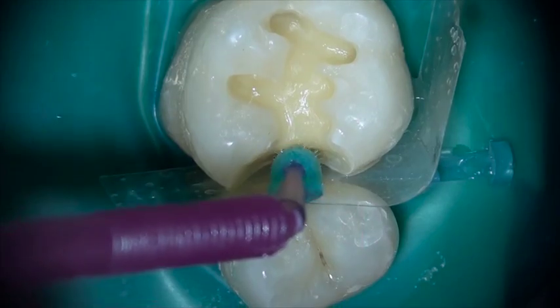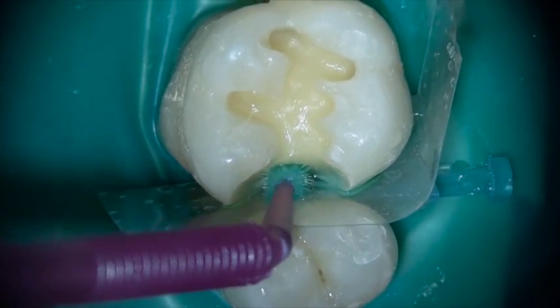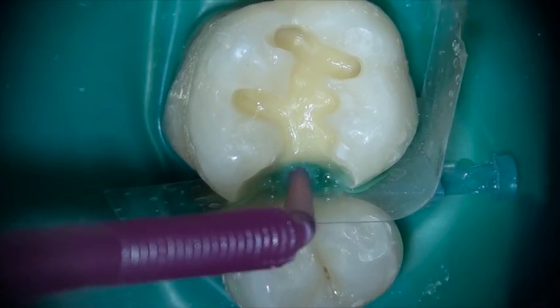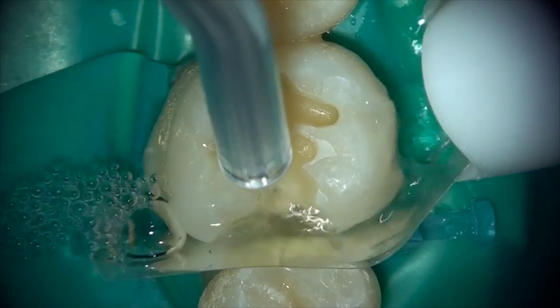Equia Forte offers great strength, fluoride release, and bulk filling capability. It comes with a conditioner that is optional, but I highly recommend you use the conditioner in that it removes the smear layer and enhances the bond strength of Equia Forte to the tooth.